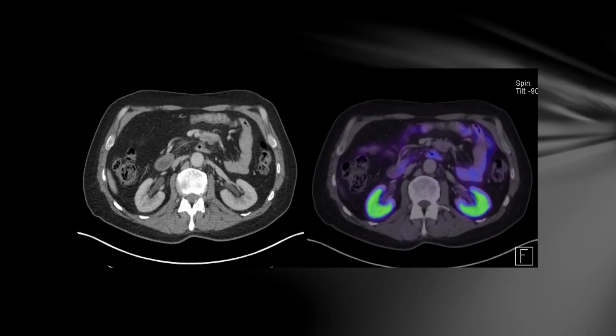which showed, you can see on the fused image there, that there's no uptake within that mass. They went forward to have a biopsy, and that actually yielded a diagnosis of a tumour called a leiomyosarcoma.